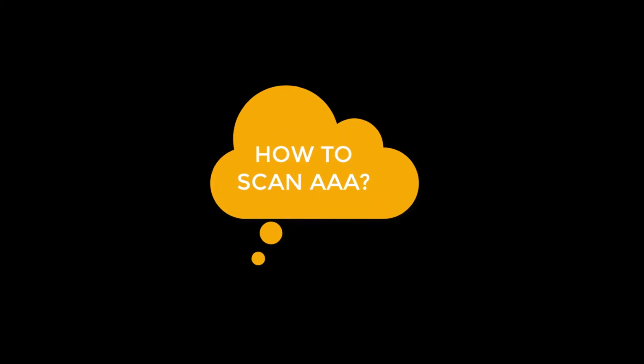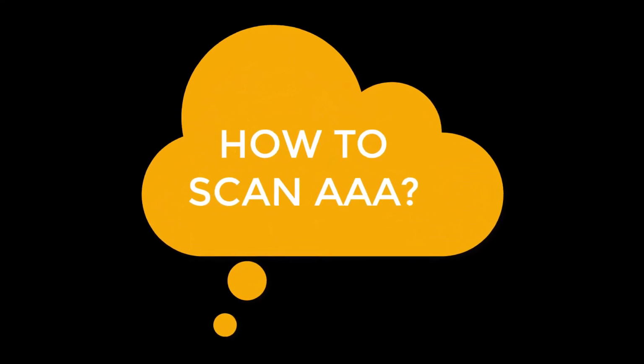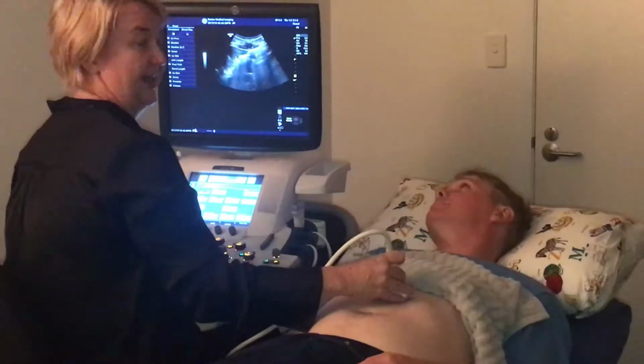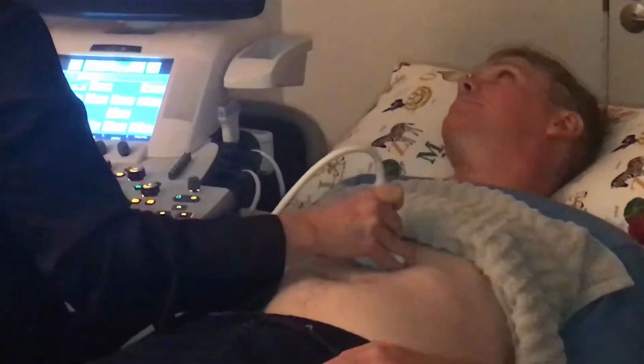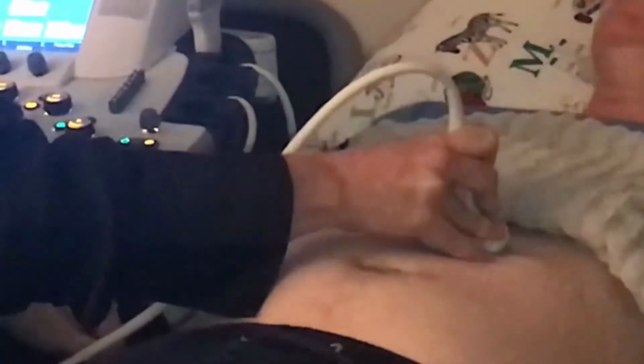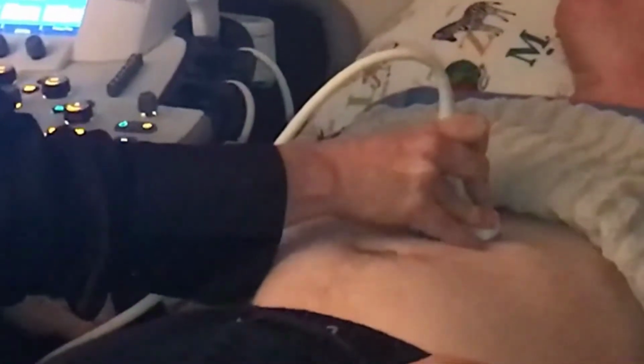Lastly, how do we scan the aorta? I will explain as we watch this scanning video. We begin the scan at the xiphisternum, which is the bottom part of your sternum, which is your bony chest where the ribs meet in the middle of your chest. The probe is kept in a transverse plane to the body as you slide the probe down the abdomen to where the aorta divides into a right and left iliac artery. This is around the level of the belly button.